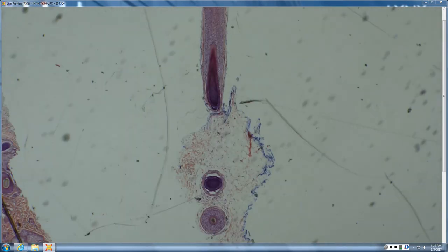Okay. And what part of the hair follicle are we in? The isthmus. Like a thick outer ridge. Probably a little deep to the isthmus, the inferior segment, where we have a big glycogenated outer root sheath. Kind of bulb area. Yeah. And then there we're at the bulb.